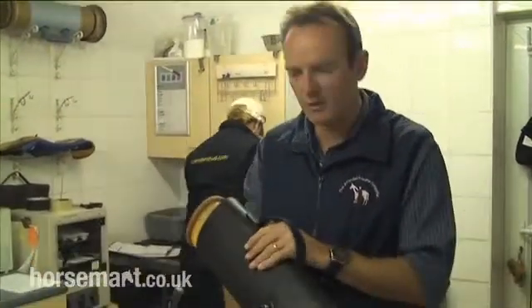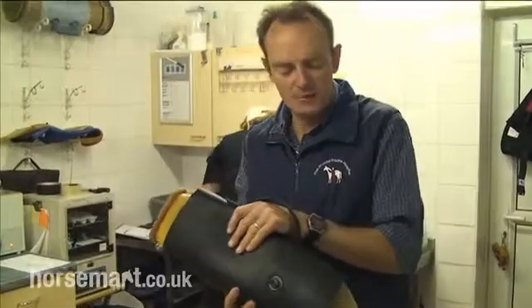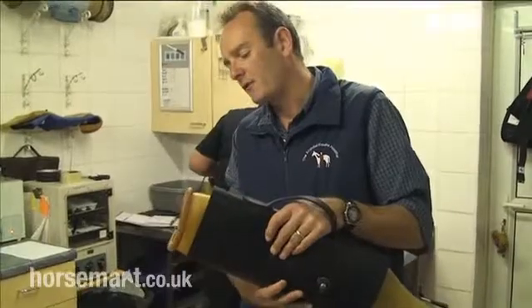When we're collecting semen from a stallion, the first thing we need is an artificial vagina. This is a water-filled jacket, the temperature of which is around 35 to 45 degrees C.